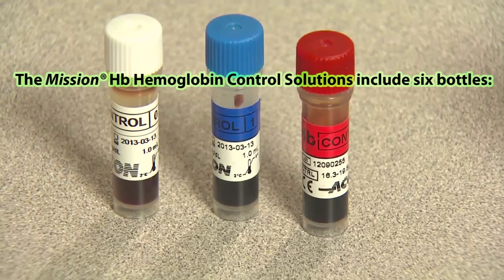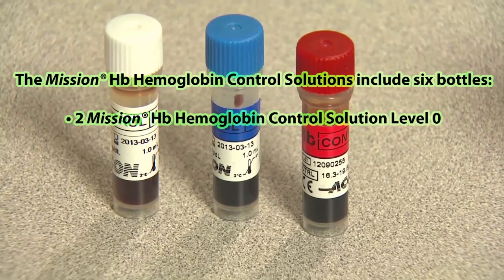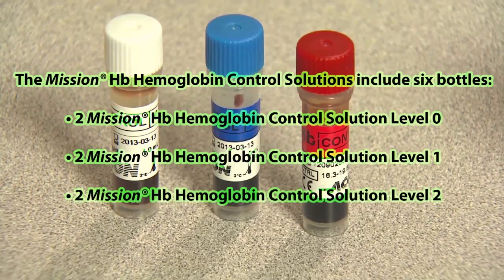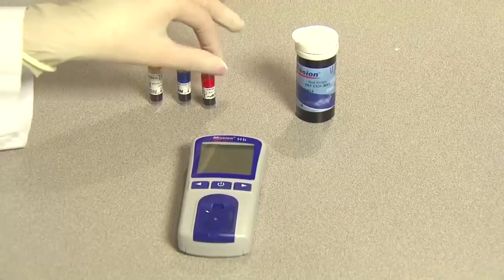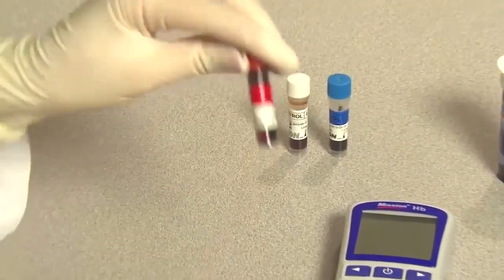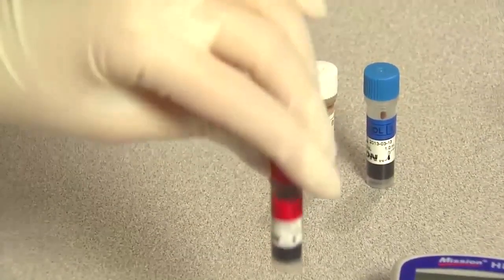The Mission HB Hemoglobin Control Solutions include 6 bottles: 2 Mission HB Hemoglobin Control Solution Level 0, 2 Mission HB Hemoglobin Control Solution Level 1, 2 Mission HB Hemoglobin Control Solution Level 2. Allow all test materials to reach a temperature between 59 to 86 degrees Fahrenheit or 15 to 30 degrees Celsius prior to testing.